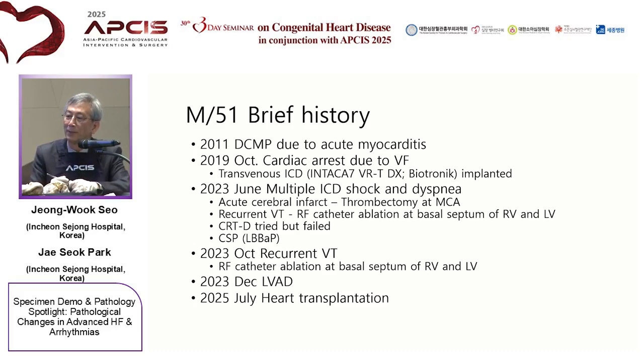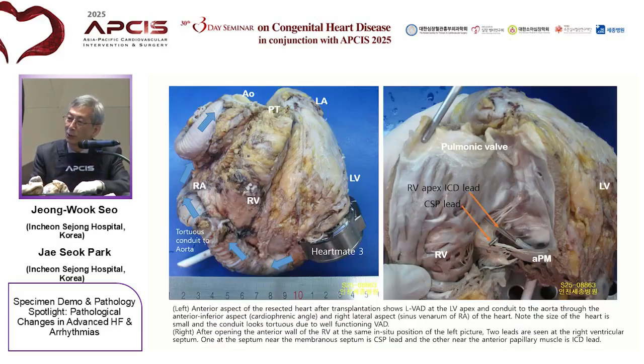So we have a heart specimen with conduction system pacing with us, and I'll show what is in the heart and show you how we can improve our conduction system pacing. Next slide, please. First of all, I'd like to show the fixed specimen picture.